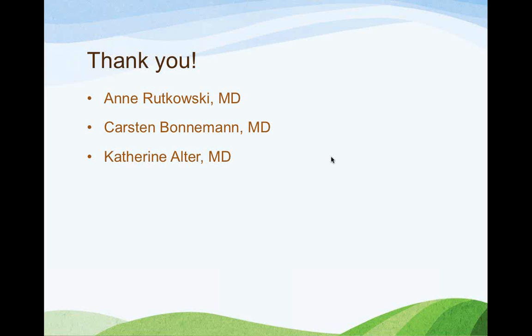So it's all very exciting, and Naz is really leading the way in terms of raising awareness by neurologists of how to use ultrasound for diagnosis. As you know, many patients with congenital muscle disorders remain undiagnosed. And you could see how in a quick clinic setting, if you could throw an ultrasound probe on somebody and make a diagnosis of RYR1 based upon the pattern of involvement, or SEPN1, how incredibly useful this would be in terms of ordering the appropriate and more focused genetic testing.